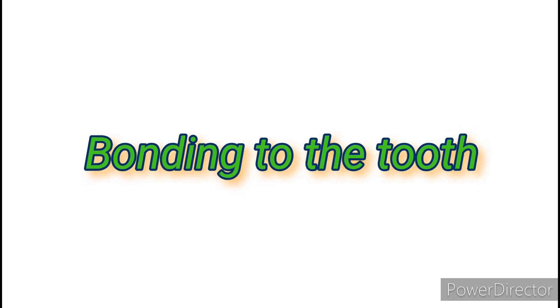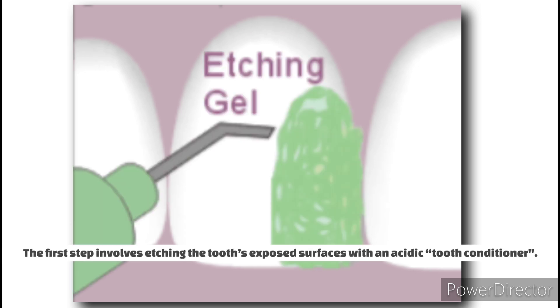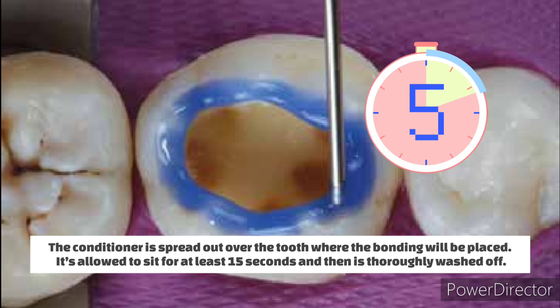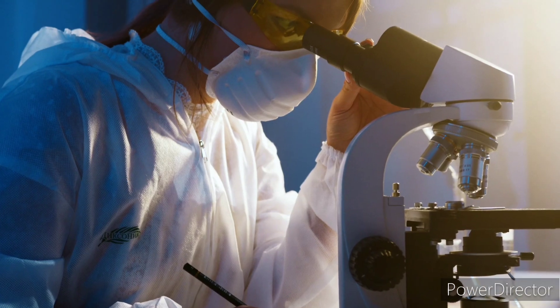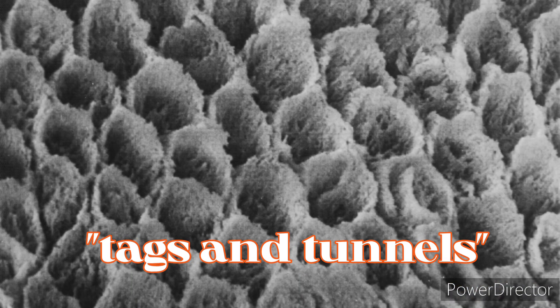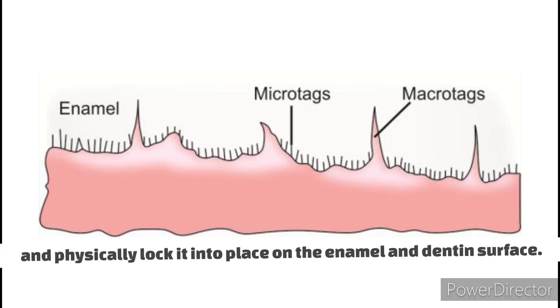How composite binds to the tooth — first is etching the surface. The tooth's exposed surfaces are etched with an acidic tooth conditioner, which normally contains 30–40% phosphoric acid. The conditioner is spread over the tooth where bonding will be placed, allowed to sit for at least 15 seconds, and then thoroughly washed off. Microscopically, etching dissolves some minerals in the enamel and dentin, creating rough features called tags and tunnels that chemically and physically lock bonding resin into place.